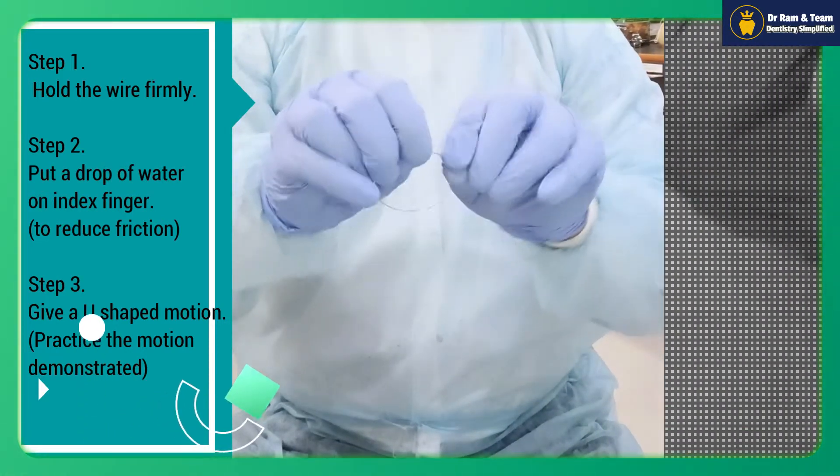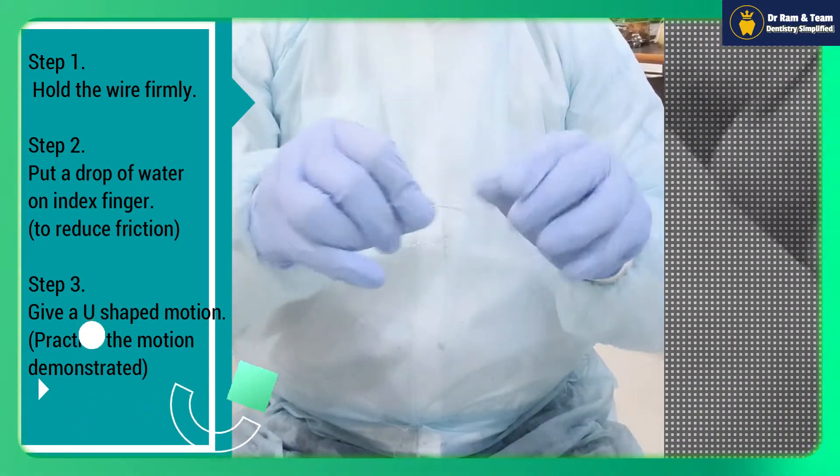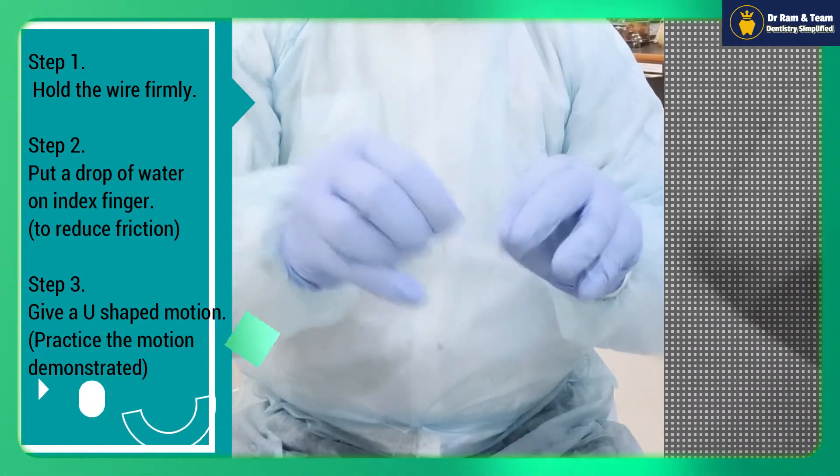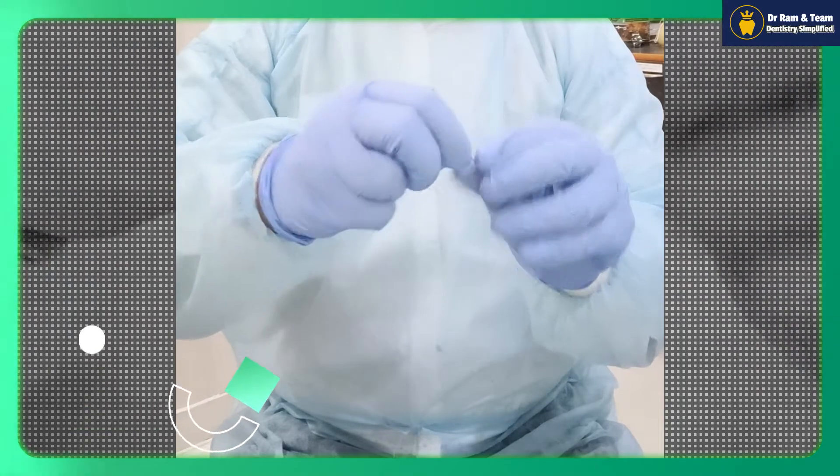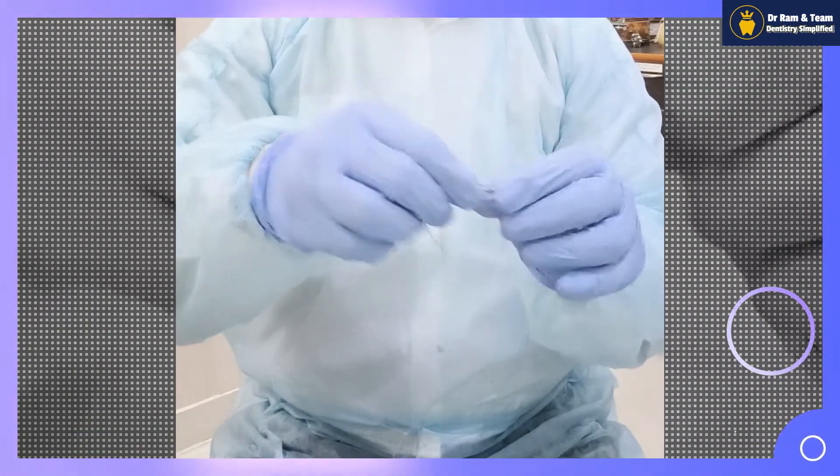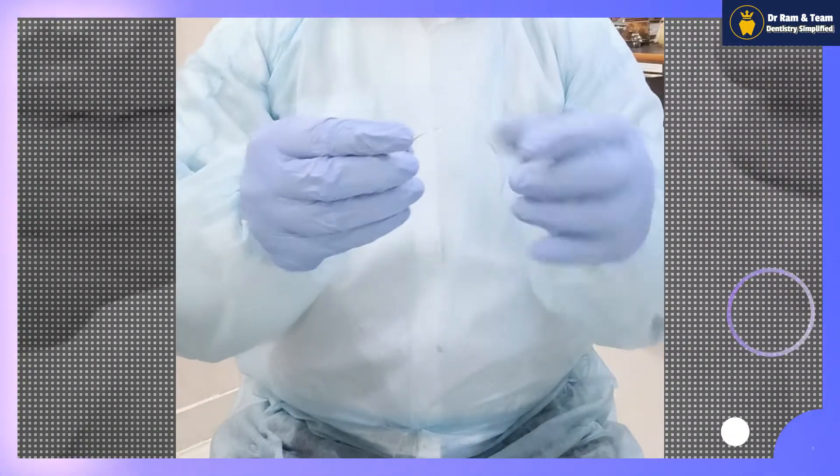Straighten the wire from the intercanine region to molar region. Keep in mind the arch form of the patient, then twist it and adjust it into the arch form which is desired by you.